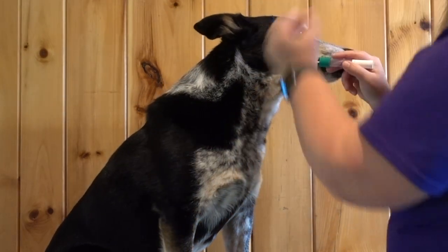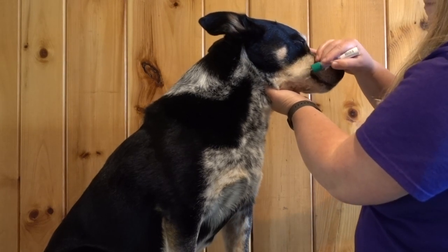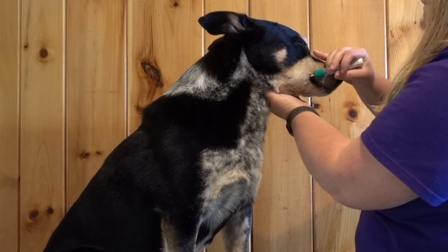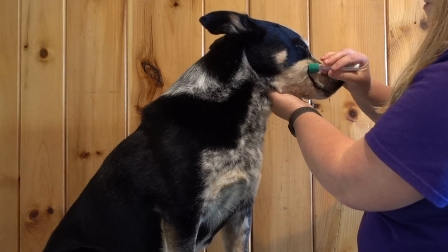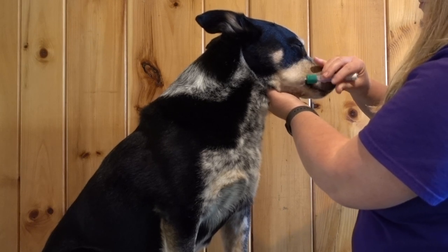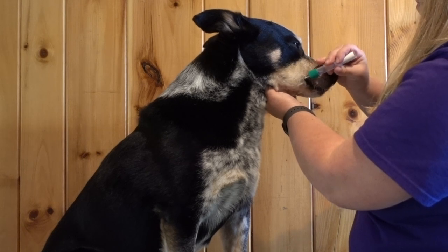One tip is to make sure you pull out some cookies before you start your swab. That way your dog sees the cookies and starts salivating — that'll give you more spit to get onto the swab and make sure that the swab is being totally saturated. Here I'm in the cheek pouch, twirling it around and rubbing it up and down, making sure that I do both sides of his mouth.